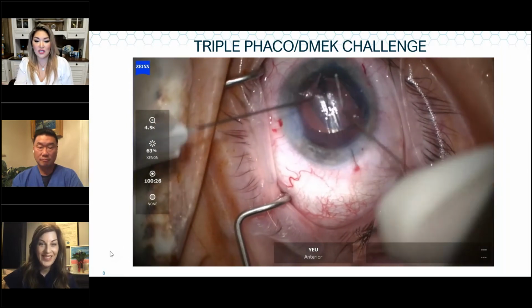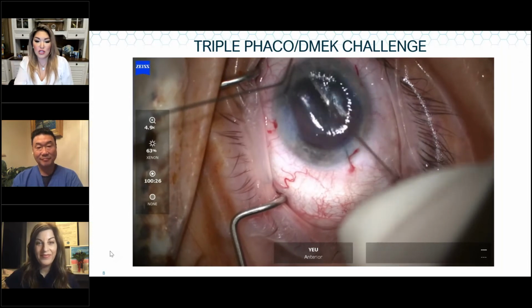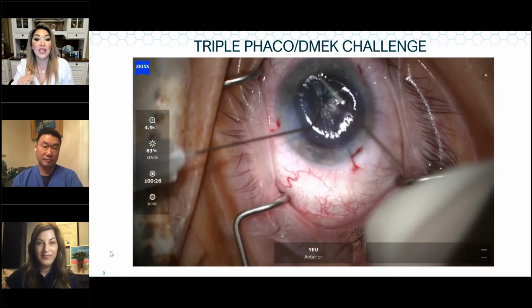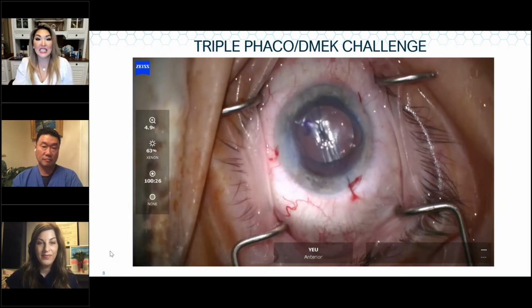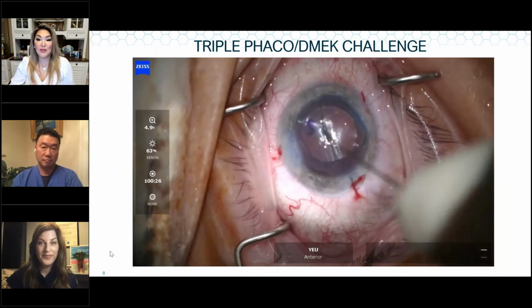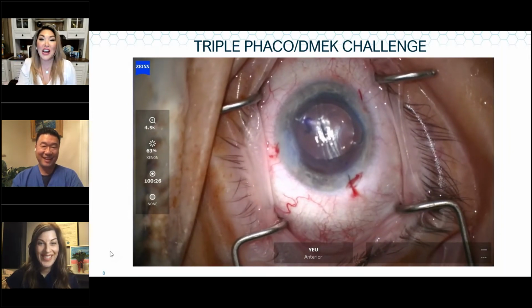You guys get the gist of it. And it just took little bits of let me release, let me release, let me just try to get it to center. And I was willing to have a slightly decentered graft if I could just get this thing to open. Right. So, Terry, Nicole, I mean, help a sister out over here.